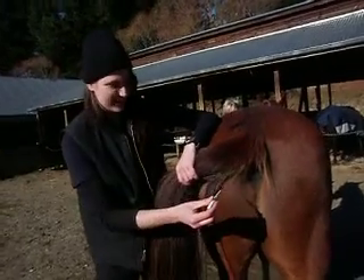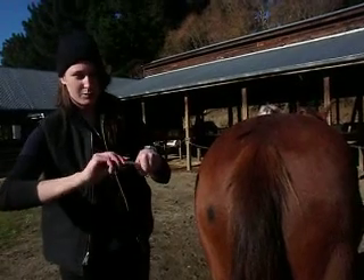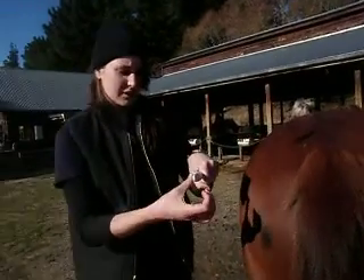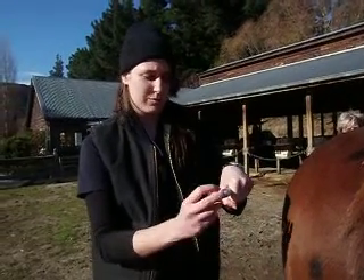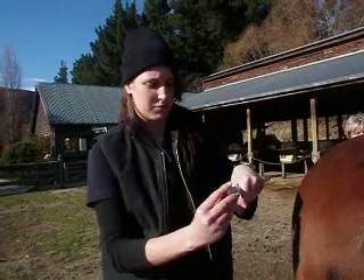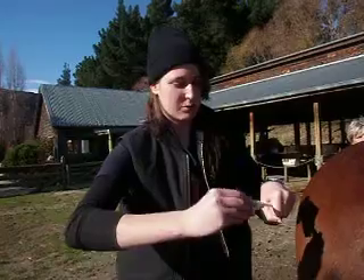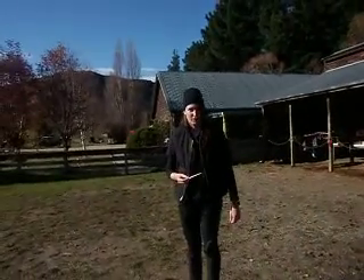This is when I would normally insert the thermometer, with a twisting motion, tilting it slightly towards the wall of the rectum and holding it there until the thermometer beeps. Then taking it out using the same twisting motion and stepping away from the horse before reading the thermometer.